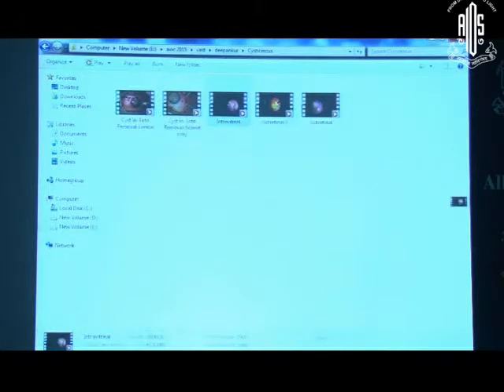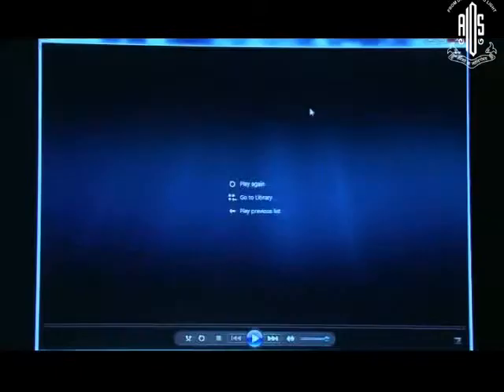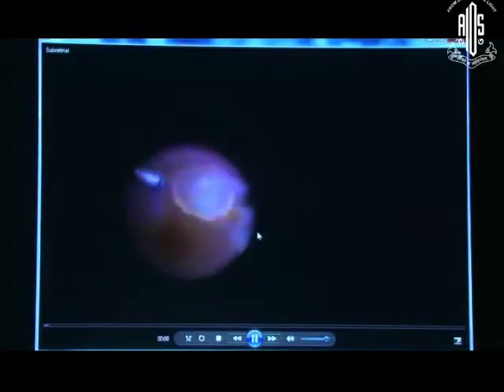A more challenging situation comes when we have a sub-retinal cyst. Like here, there is a paramacular cyst lodged right under the retina. So after a basic PVD induction, we use diathermy and a blade to make a small opening inside the retina. Then by using a soft tip and active suction, we can gently pull out this cyst from underneath the retina.